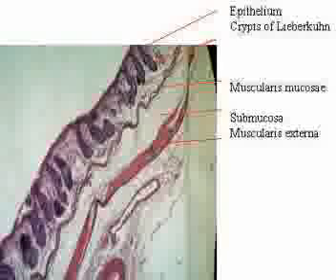Colon can be distinguished from the rest of the gastrointestinal tract by the absence of villi.